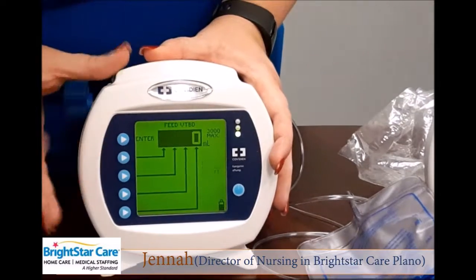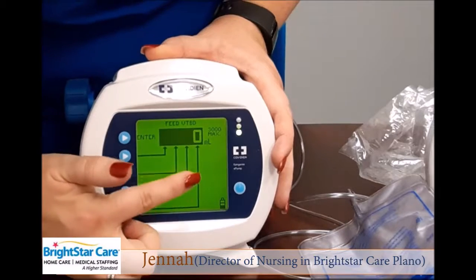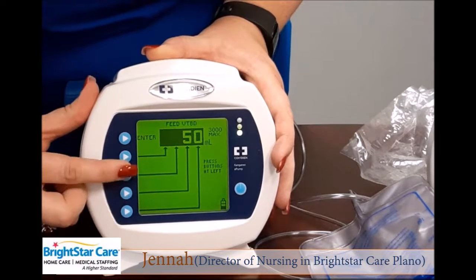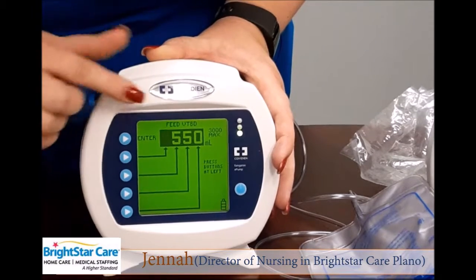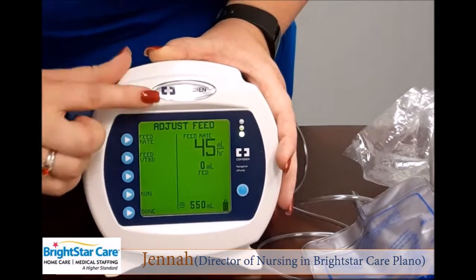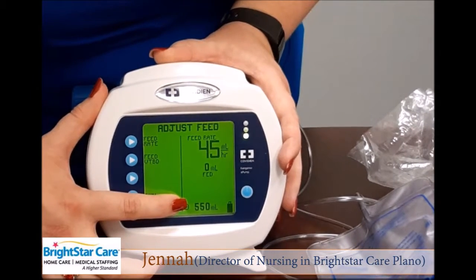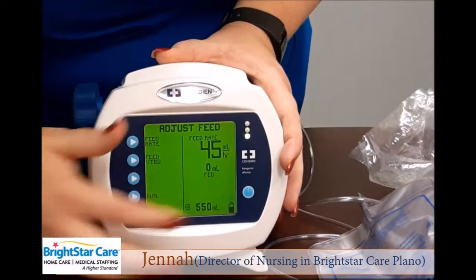Let's say in this case that our physician wants us to go ahead and infuse 550 cc's. I already have a 0 in my ones place. I'm going to put a 5 in my tens place. I'm going to put a 5 in my hundreds place, and I'm now showing a volume of 550 cc's. I'll hit enter. Now if you notice on my home screen, I have a rate of 45 cc's an hour. I have a volume total of 550 cc's, and my machine is telling me I have infused 0 cc's of my total volume.